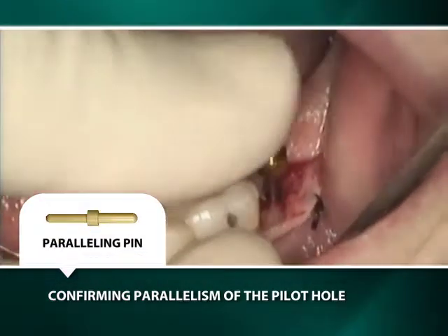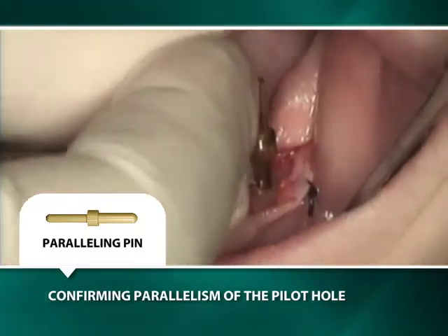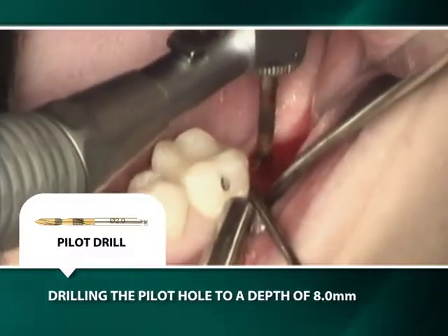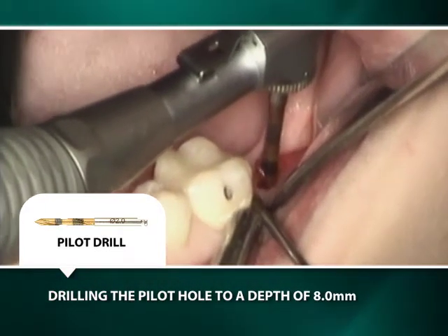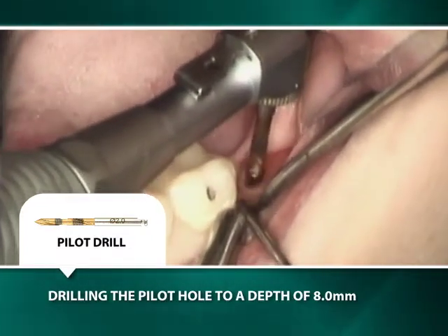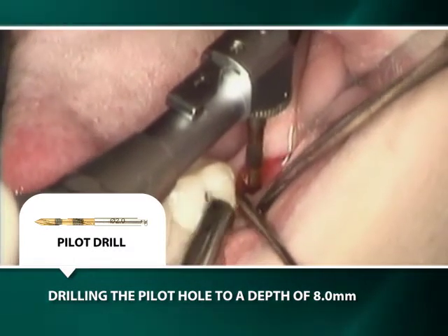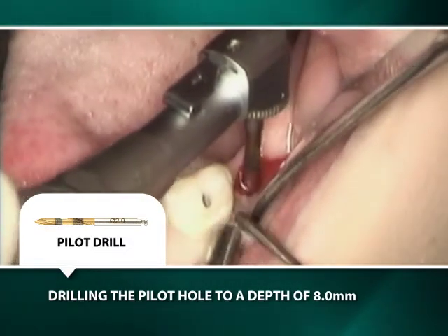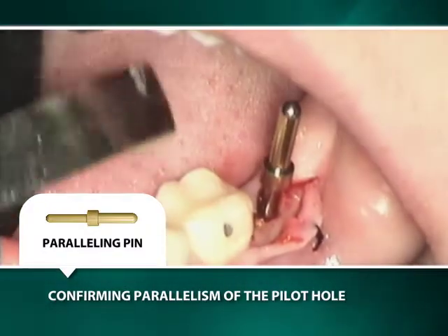The initial positioning of the osteotomy is confirmed by inserting a paralleling pin into the pilot osteotomy. Since the pilot osteotomy is too close to the first molar, the side-cutting properties of the pilot burr will be employed to move the osteotomy distally. Because there is adequate depth of bone, the osteotomy is prepared to a depth of 8 mm, thus avoiding the compromising effect of the sloping buccal plate, which often results in loss of buccal bone height as the osteotomy is widened. The paralleling pin confirms the appropriateness of the changed angulation of the osteotomy.